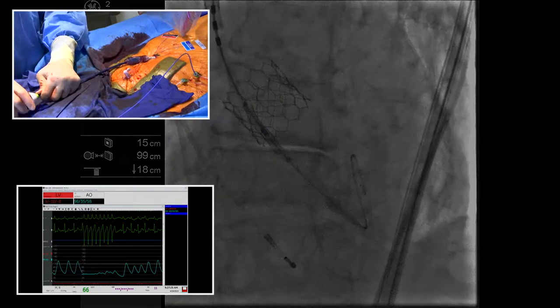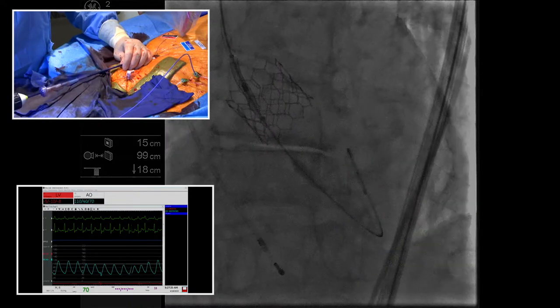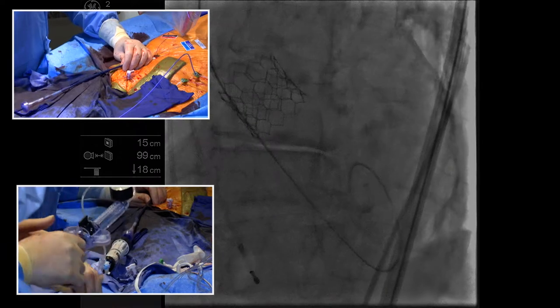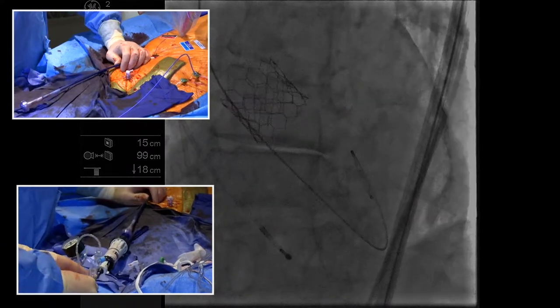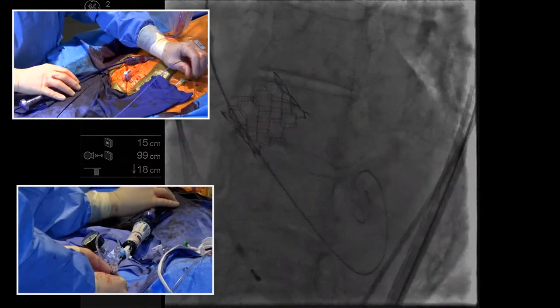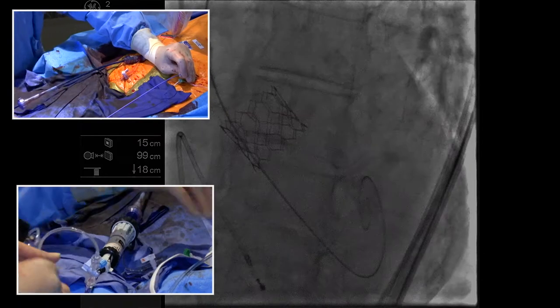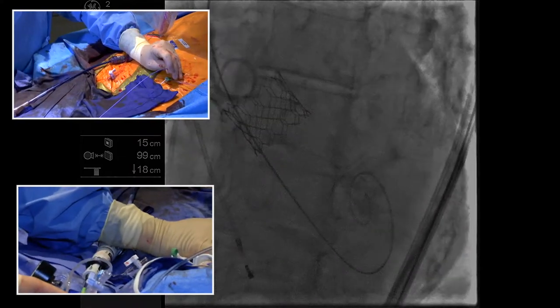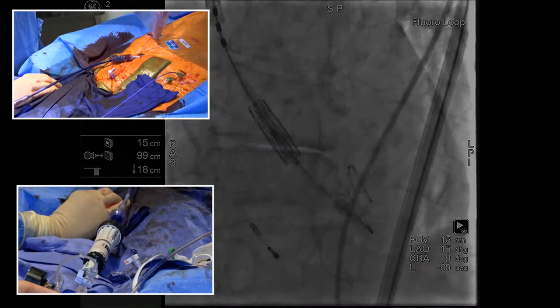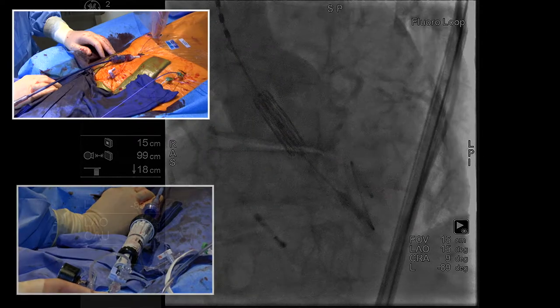I'll take the bend off the catheter. There's a couple of things I do right now. First, the valve is not really coaxial, so I'll change my view to make it coaxial, which I just did. Before I do, I always like to do this, it makes me feel better, just a little puff for 2 seconds here. So the valve landed beautifully, and we can show you the deployment. Again, we made sure we were in the right spot.